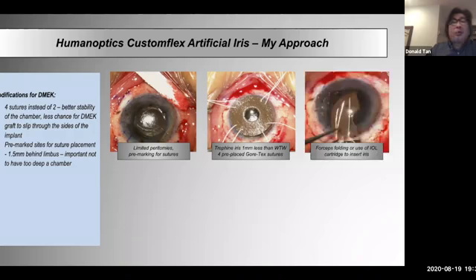This is then either folded in through the incision, the size of which will vary depending on whether you're using folding or an IOL cartridge. But on average, I tend to make about a 4 millimeter wound. I can use forceps in this case, and it's quite standard. You just insert this in the usual manner, similar to an IOL, I suppose.